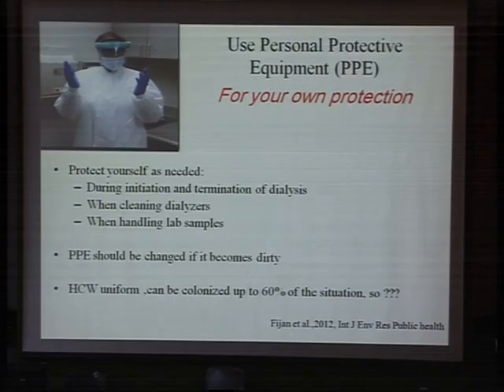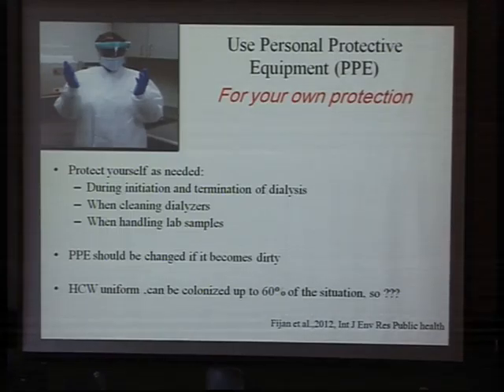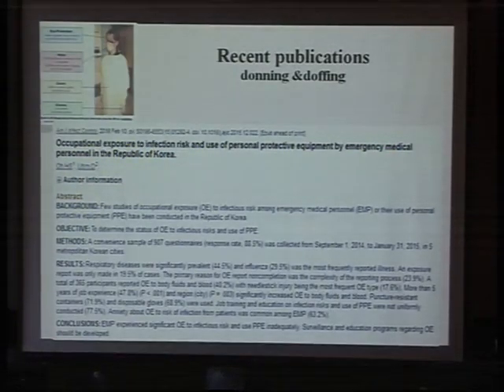Use the equipment, as I mentioned before, during initiation, termination, cleaning, and handling. Once it looks dirty, you should change it fast. As I told you, contamination by bacteria is possible. Okay, this is the reason about personal protective equipment.